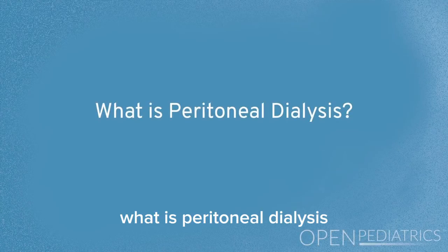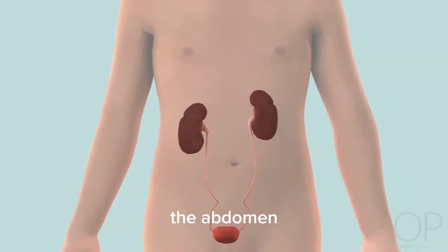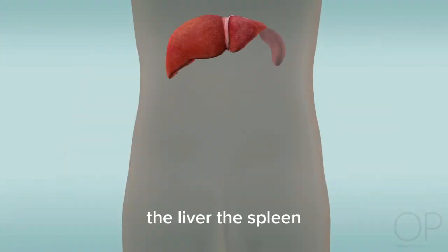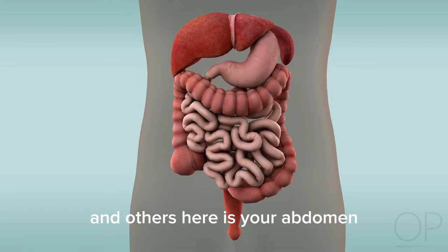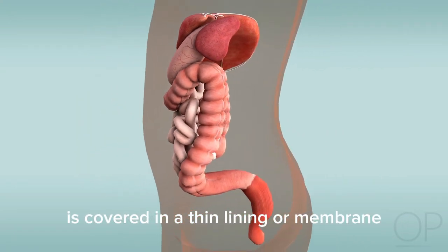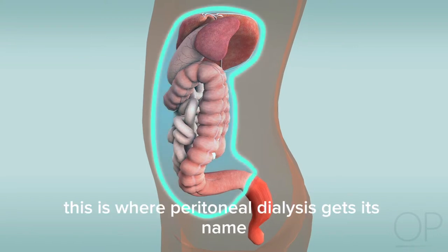What is peritoneal dialysis? Inside your child's belly, also called the abdomen, there are organs just like the kidneys: the liver, the spleen, the intestines, and others. Here's your abdomen. Inside of the abdomen is covered in a thin lining or membrane, which is called the peritoneum. This is where peritoneal dialysis gets its name.